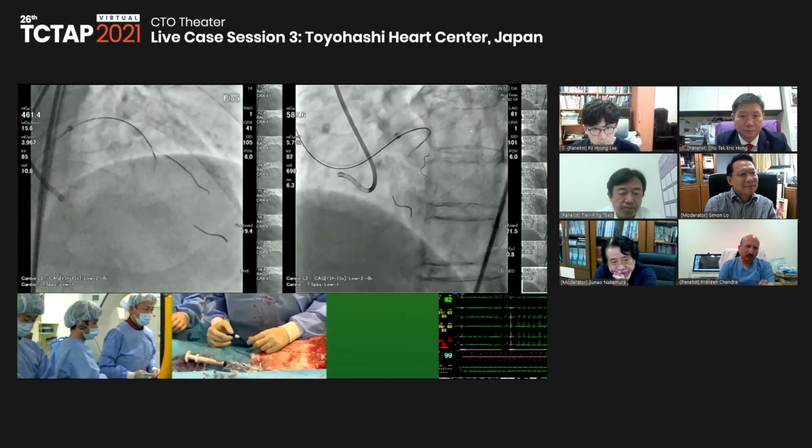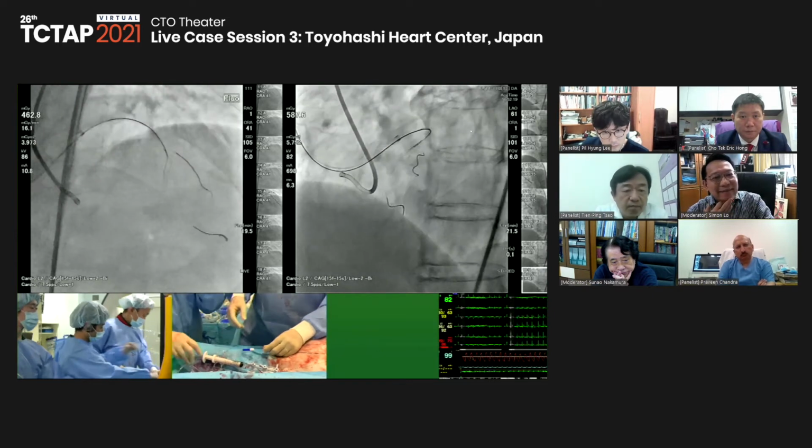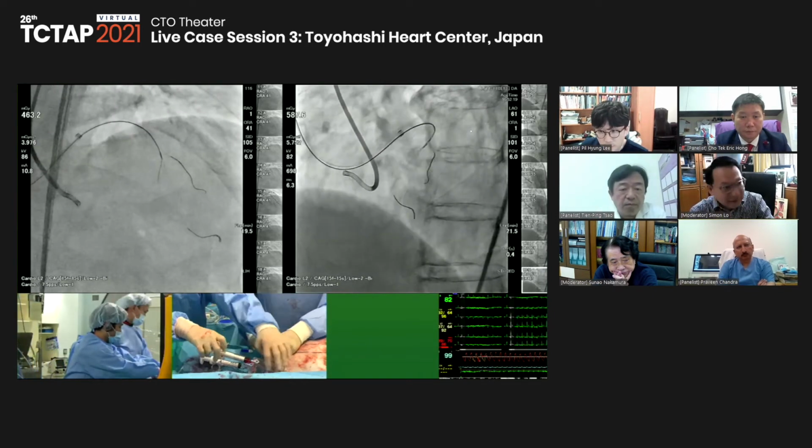Yeah, XTR is advanced gradually. So now it's time to check the contralateral injection.